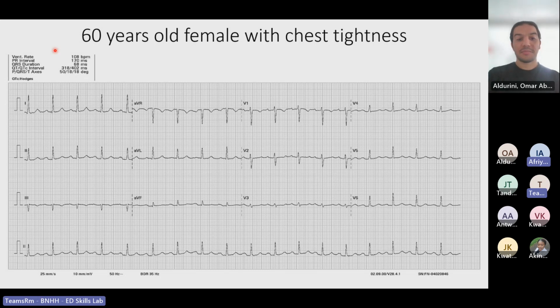So to me, I realized that this ECG is more or less normal. We'll speak about each change later. Thank you, Isaac, for this. These are the steps. My main purpose for this lecture is just for you to learn the system of thinking and how to interpret, not to find any abnormalities at the moment. We will just find them together as we go on.